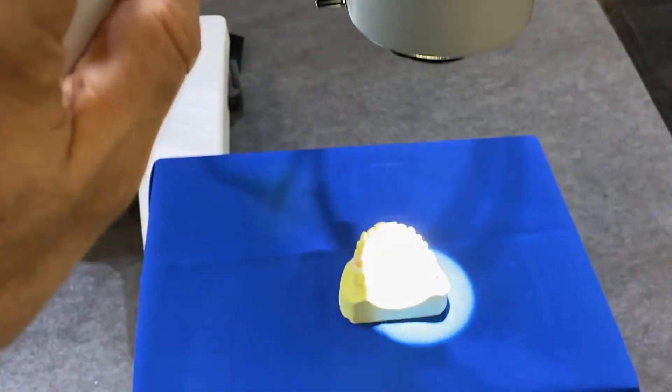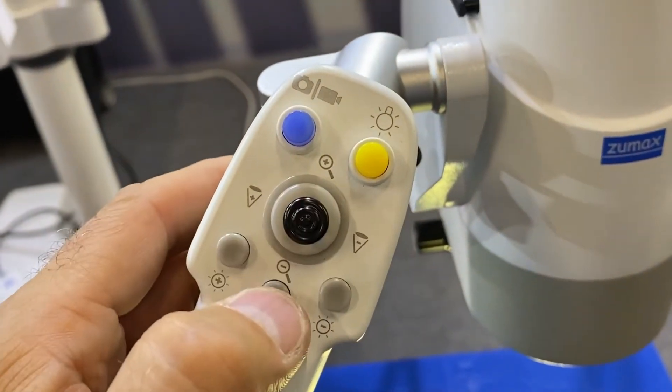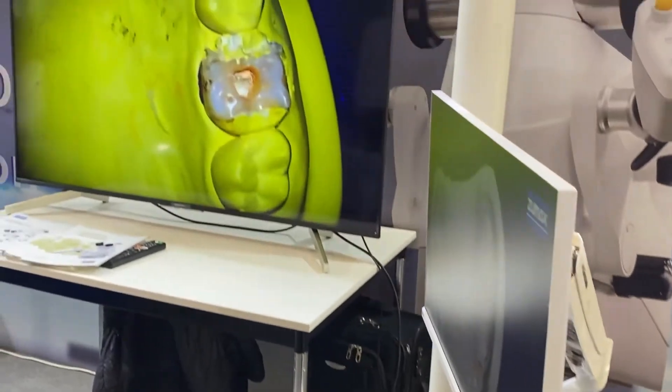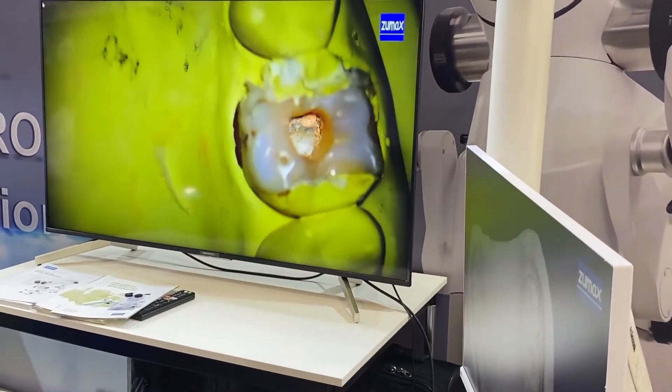You can activate or deactivate the light here. You have the magnification here up or down. So if I go up I will increase the magnification. If I go back down I reduce the magnification.